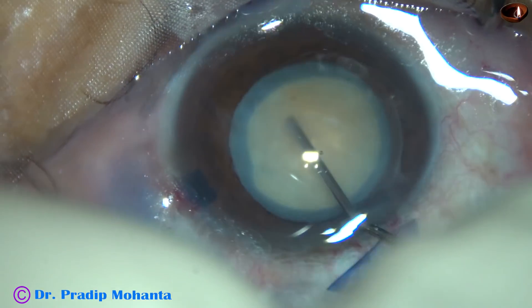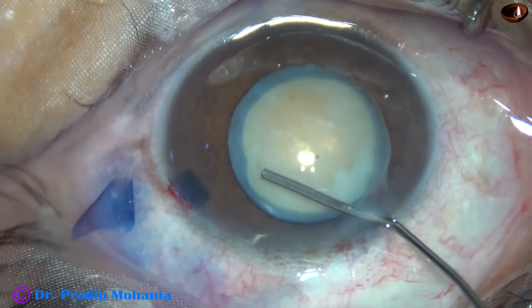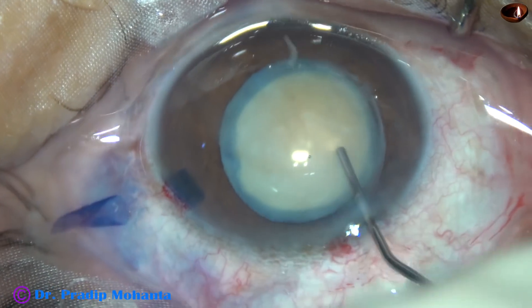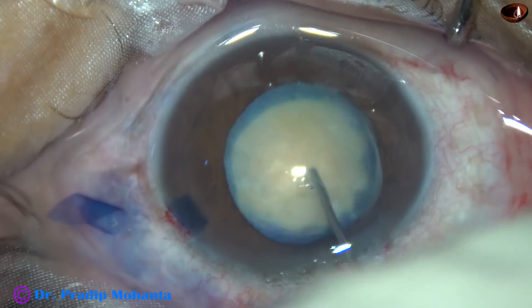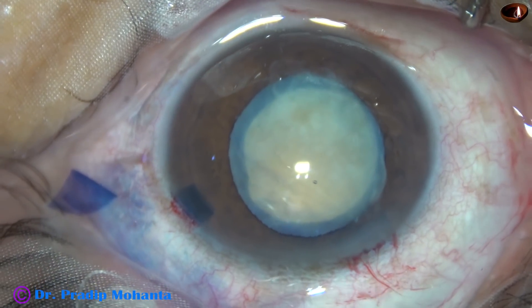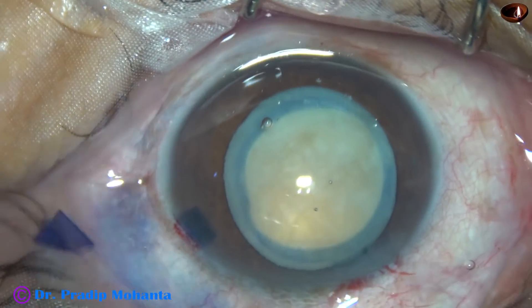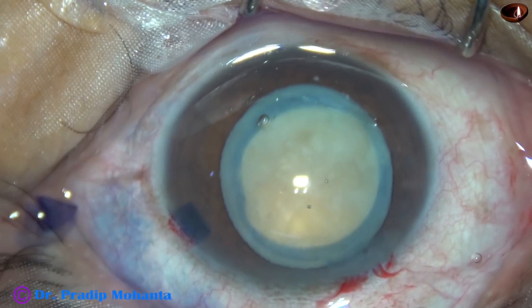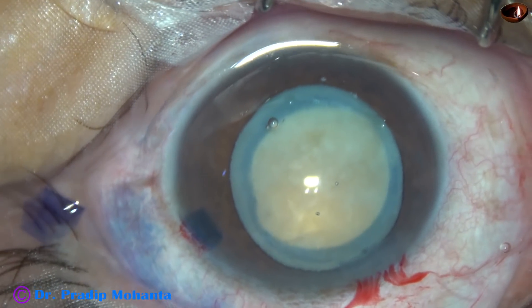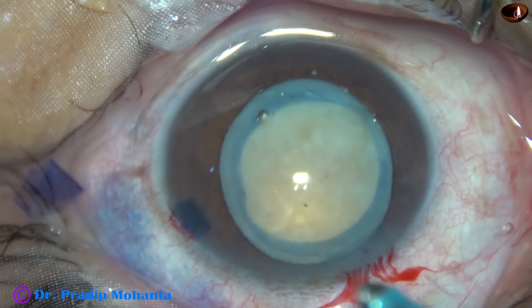And now, I am going to irrigate out the milky fluid. Hydrodissection is not required in such cases — the nucleus is already free. But I did a little bit of hydrodissection in this case, and the nucleus rotates nicely. Visco is injected again. And now, I am going to introduce the tip of the phaco needle. At this time, I have no idea how hard the nucleus is.